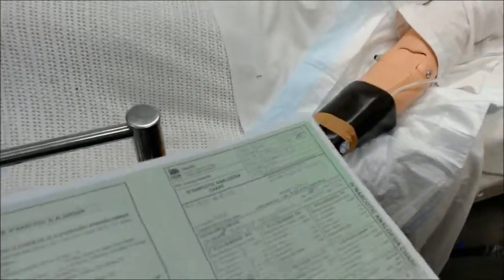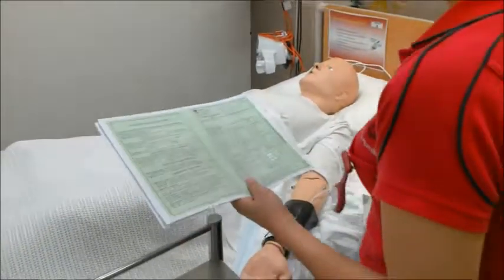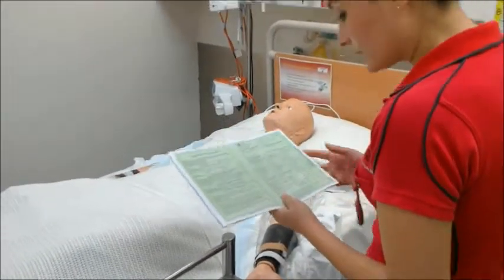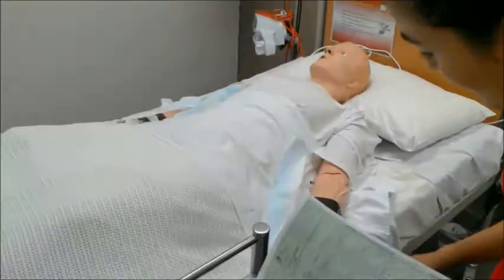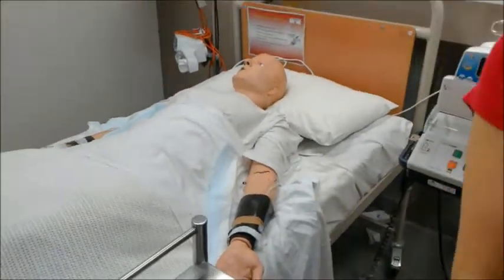Mrs. Adib, are you allergic to anything? No. That's good. Do you still have pain? Yes, I do. How would you score your pain out of 10? 10 is being severe pain and 0 is being mild pain. 8. 8 is still 8. Okay. Do you feel pain when I touch here? No. No swelling, no redness, nothing there. Okay, I'm just going to prime your line.